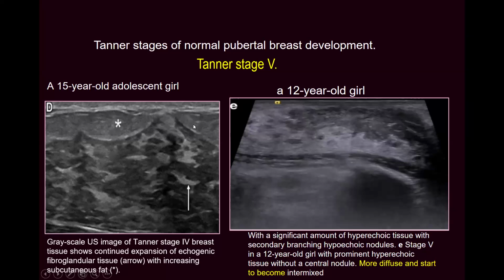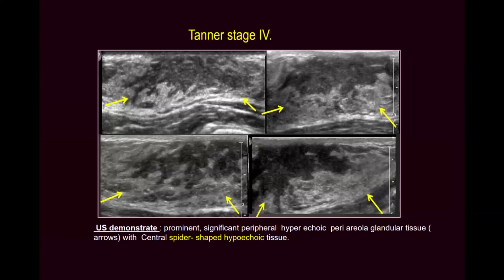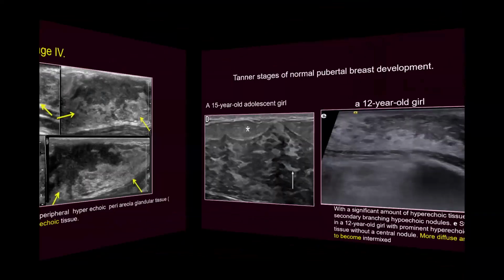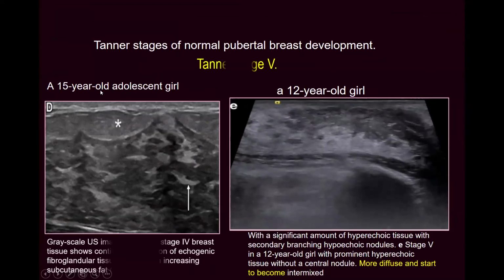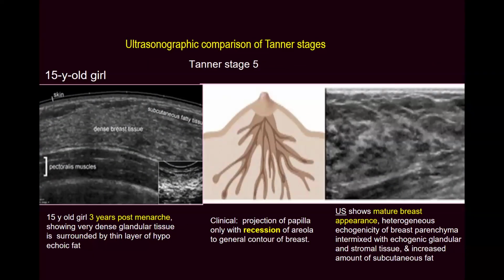And now you can see the subcutaneous fat increasing and appearing, not like in the previous. Here you cannot see subcutaneous fat, but here you can see even the layer of subcutaneous fat, well formed. Are you following me? Yes, yes. Okay.